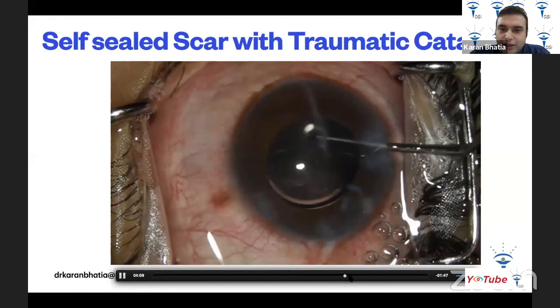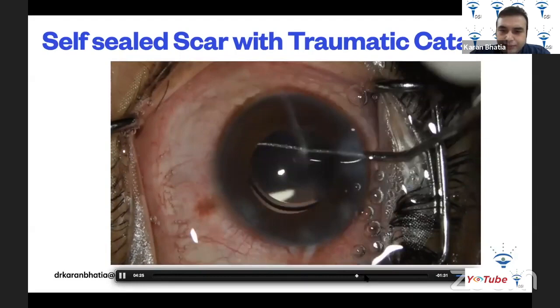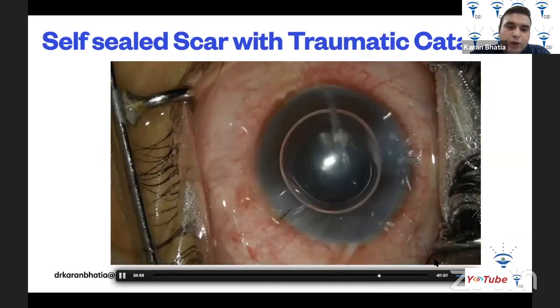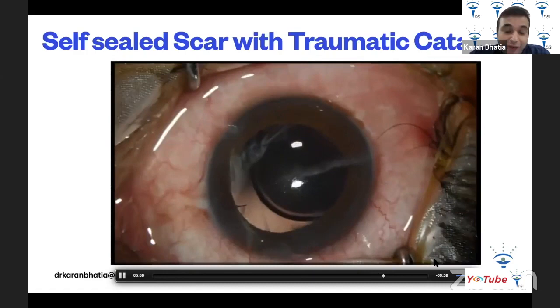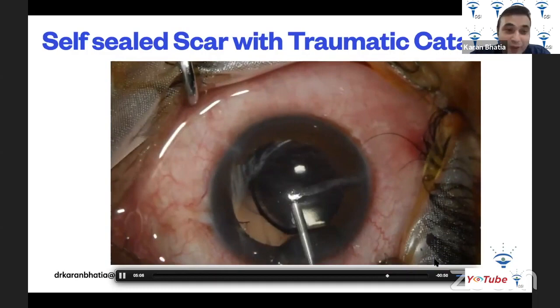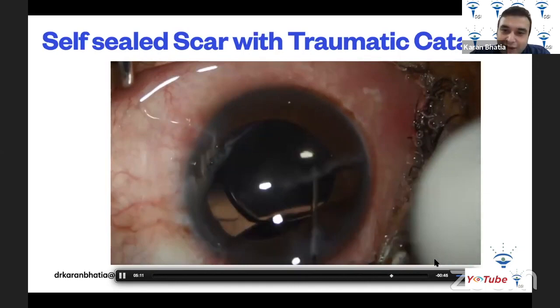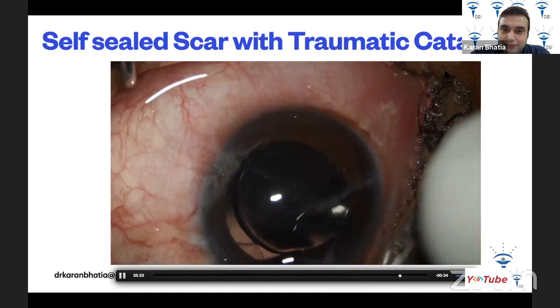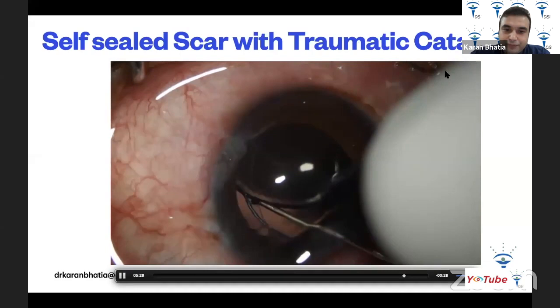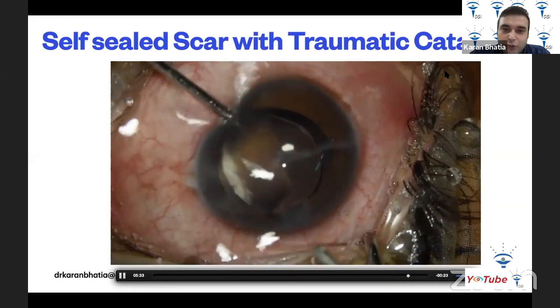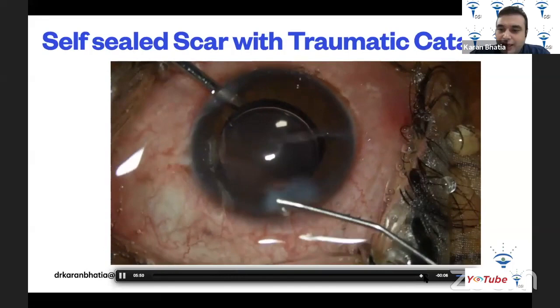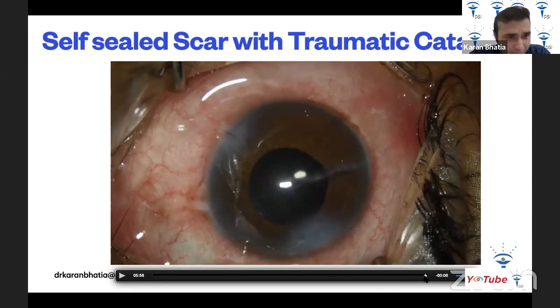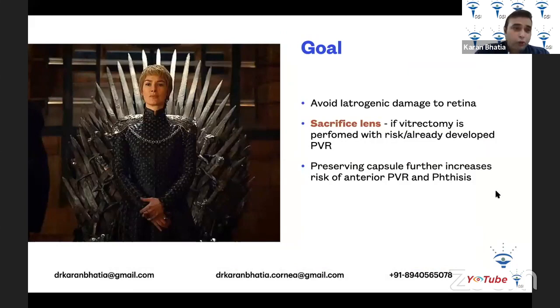The surgery looks good and the lens is in the bag. However, on POD1, the lens is found to be decentered — these traumatic eyes don't behave like normal cataract cases because the support system is damaged. The lens is redialed back into position very gently. The eye looks good at the end of the revision surgery, and the patient achieves a vision of 6/18 or 6/12 unaided on POD2.